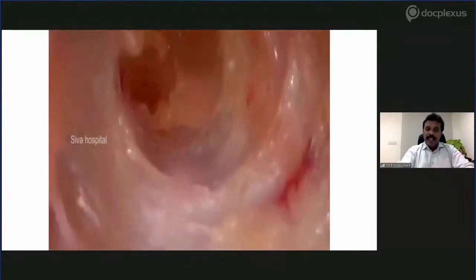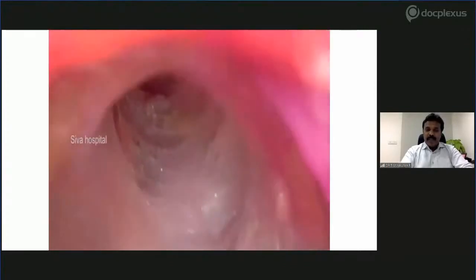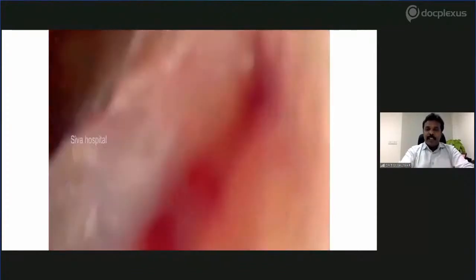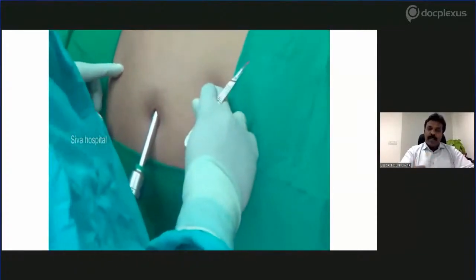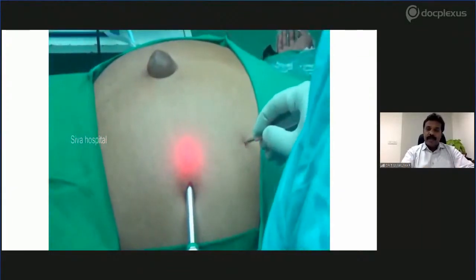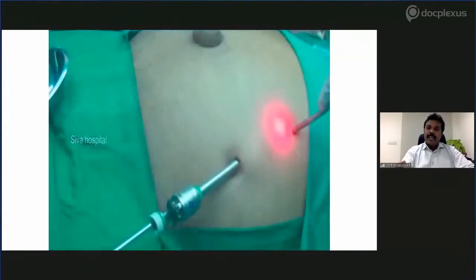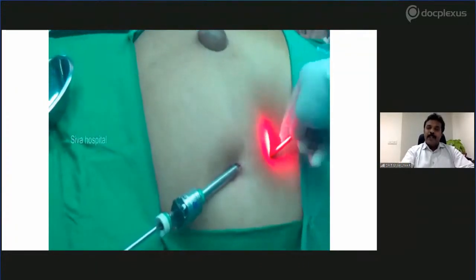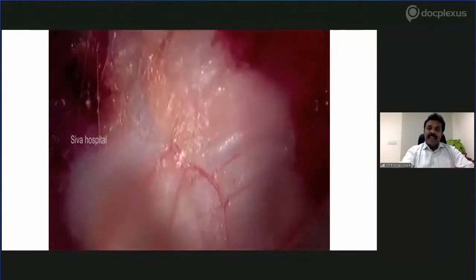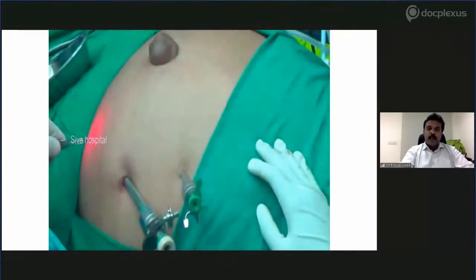Where you are entering is the subcutaneous plane, Scarpa's fascia. Just dissect from there with your 10 mm 0-degree scope, using a to-and-fro approach with 16 mm of mercury pressure. You will be creating a plane in the subcutaneous plane. Then introduce your 5 mm port in the mid-clavicular line, right side, under visualization with the 0-degree scope, or you can change to the 30-degree scope.